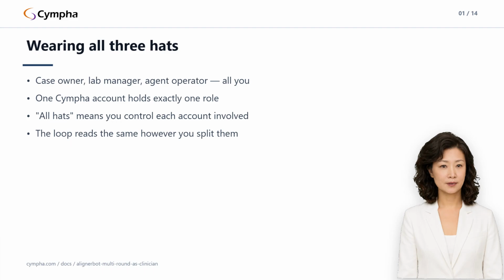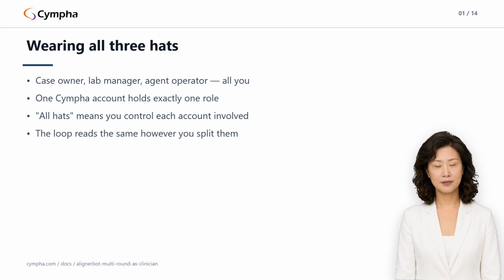That might sound like overhead, but it's what makes the solo setup honest. Every handoff in the pipeline still happens, still gets logged, still sends its emails. You're just on both ends of each one. And it means everything in this lecture reads the same no matter how you've split the accounts. When I say as clinician or as lab manager, I mean whichever of your accounts holds that role.